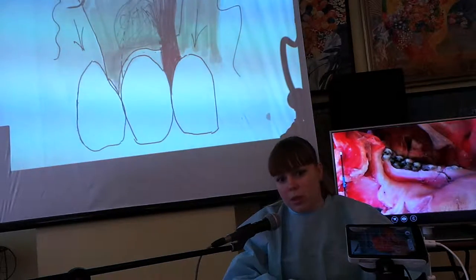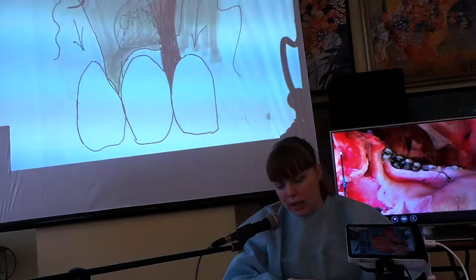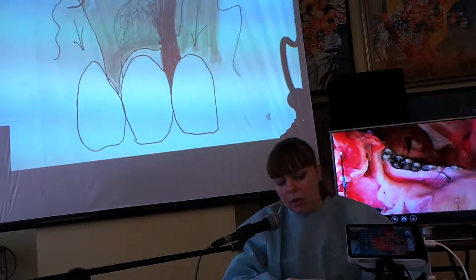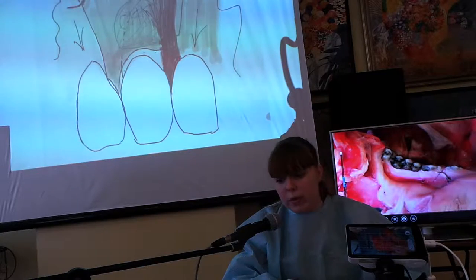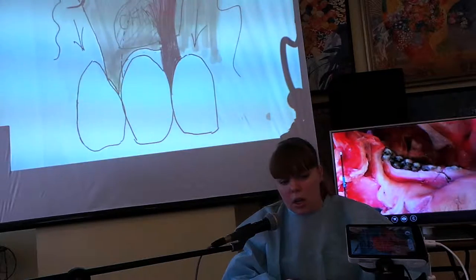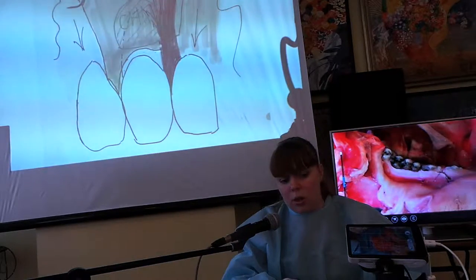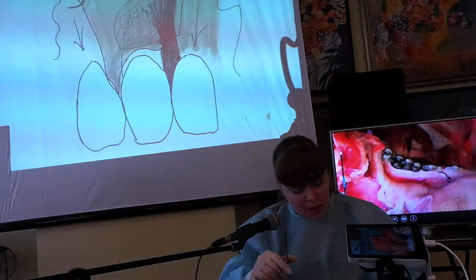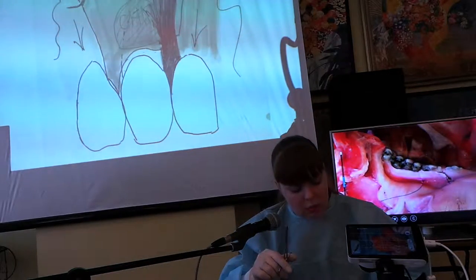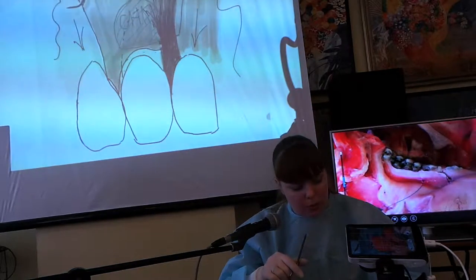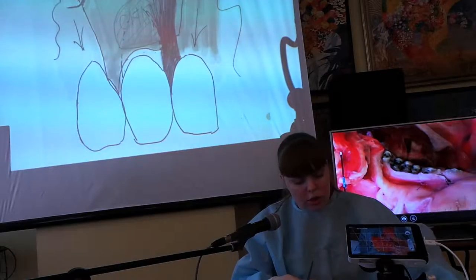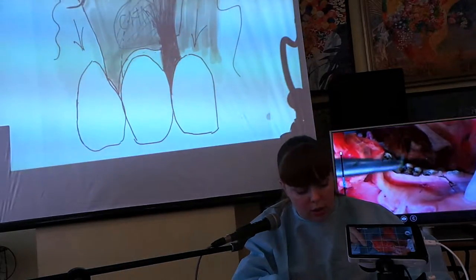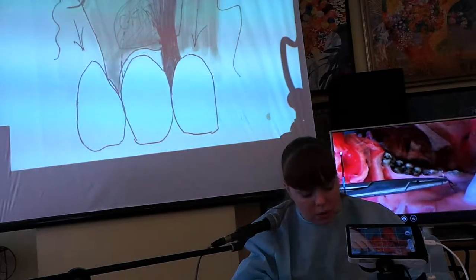Ткани зоноспецифичные для этой операции, которые позволяют потом полностью нивелировать зону вмешательства и какой-либо эстетический дефект. Сейчас я повторю на соседнем зубе и продемонстрирую ещё раз двойной петлевидный обвивной шов.